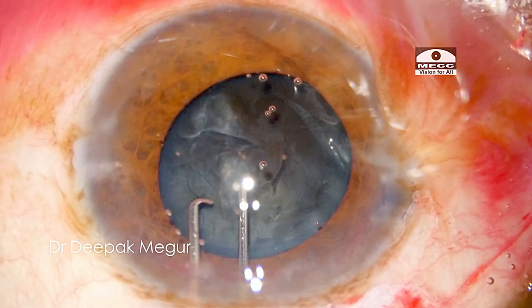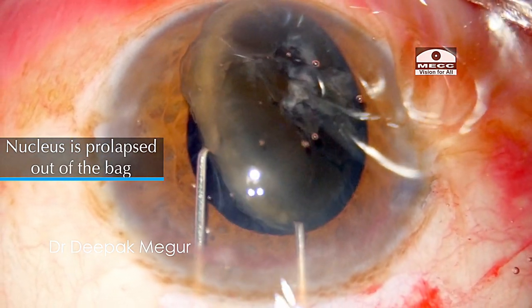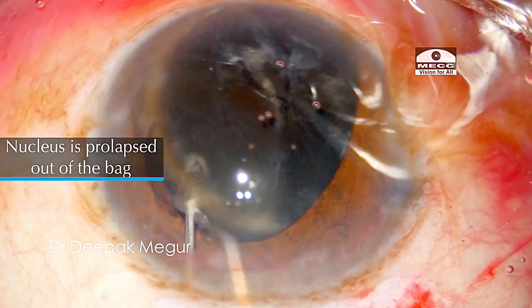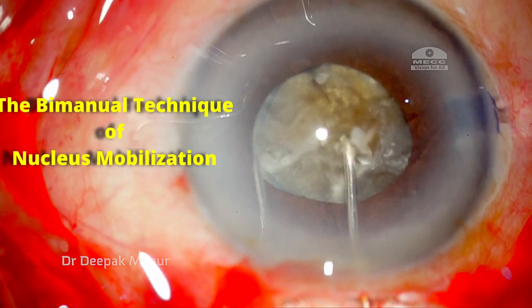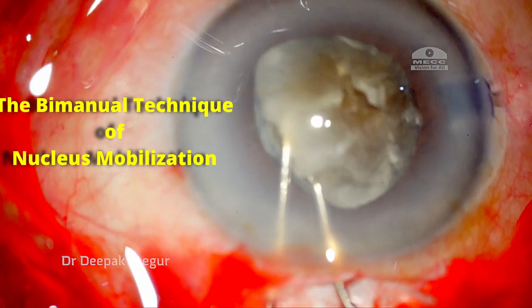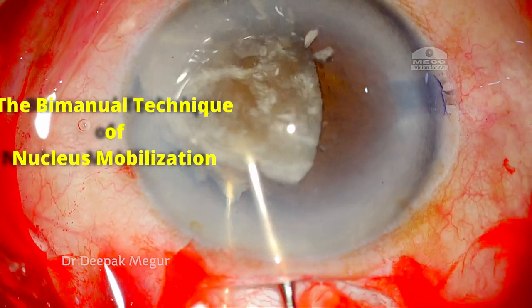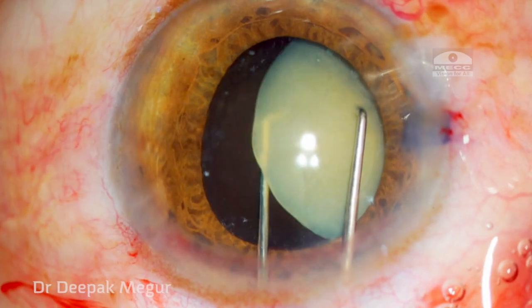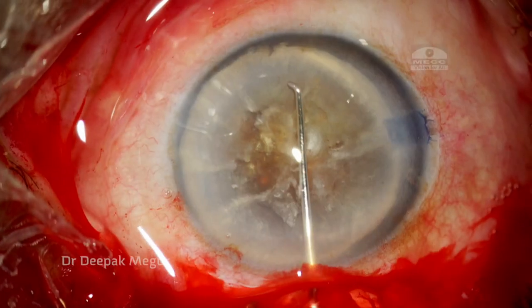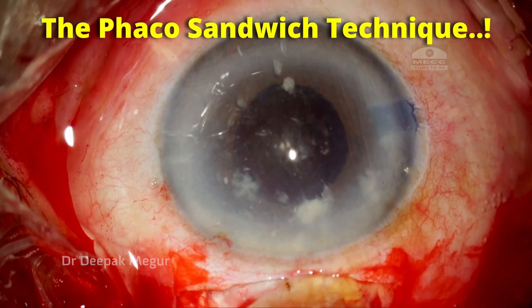The take-home message is to master the art of mobilizing the nucleus out of the bag using the bimanual technique. Mastering the bimanual technique helps mobilize the nucleus through smaller rhexises and also in complex situations such as small pupil, weak zonules, etc. The phaco sandwich technique is the preferred technique for a beginner, and later on the surgeon can always graduate to nucleus division techniques.